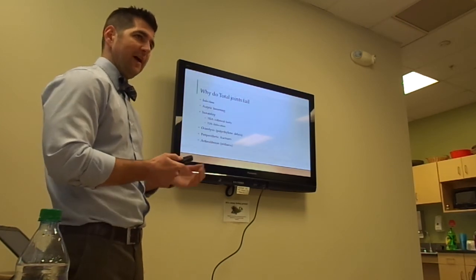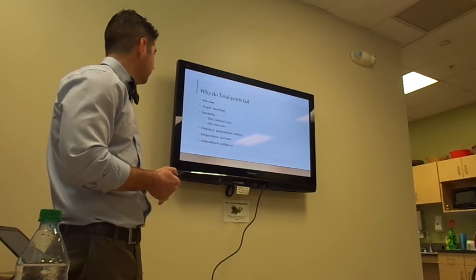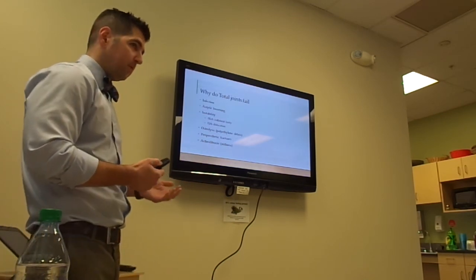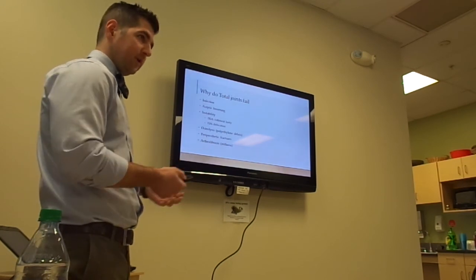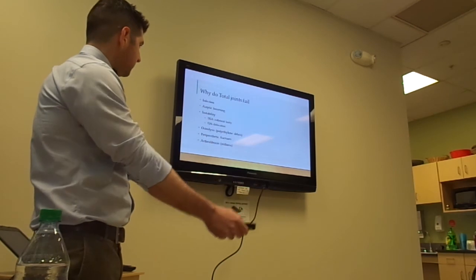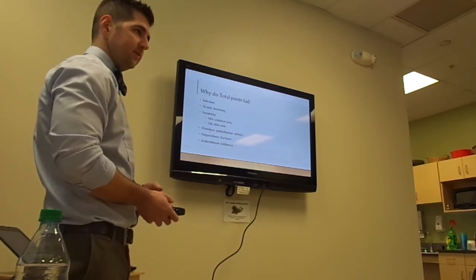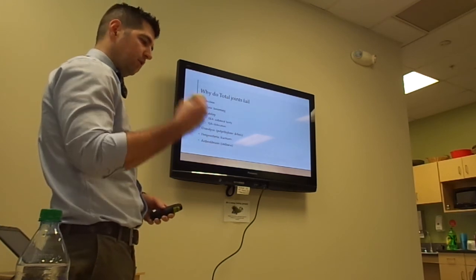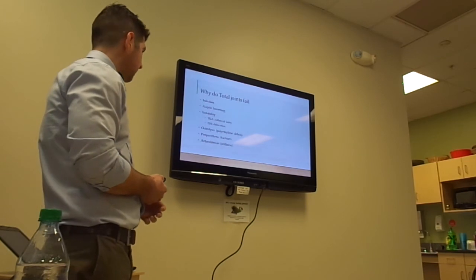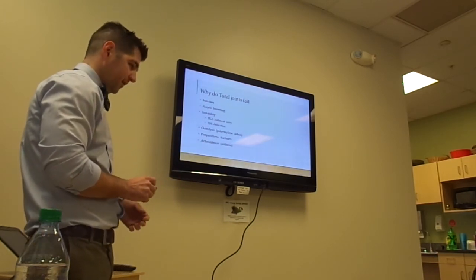on the plastic, and that leads to a larger socket now that the ball's not sitting in as well, and will lead to dislocation. So those, oftentimes, we won't let them go through a second time. We know what the problem is, we try and identify it and get it taken care of. Osteolysis, much less common now that we have the third generation of cross-linked polyethylene, much fewer plastic particles, much less bone response, causing resorption of the bone. Periprosthetic fractures, and then stiffness or arthrofibrosis.